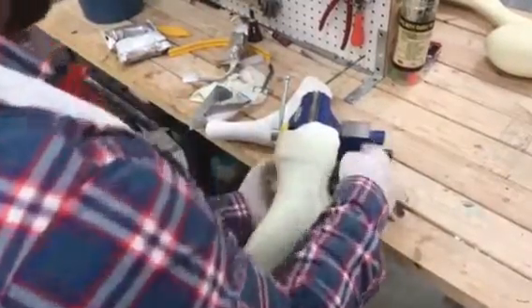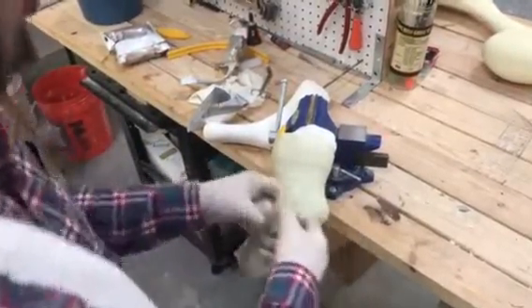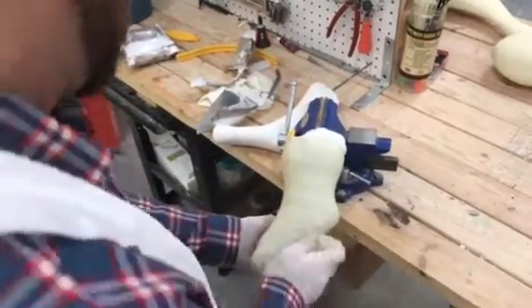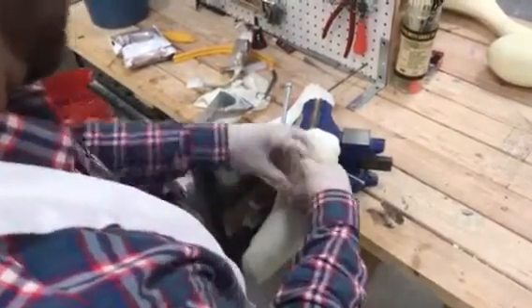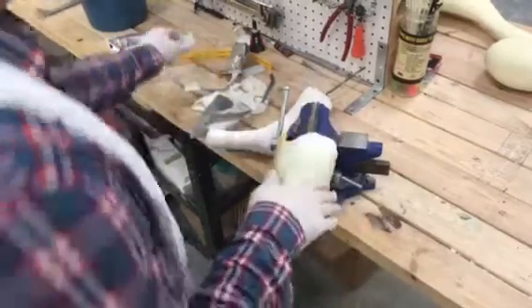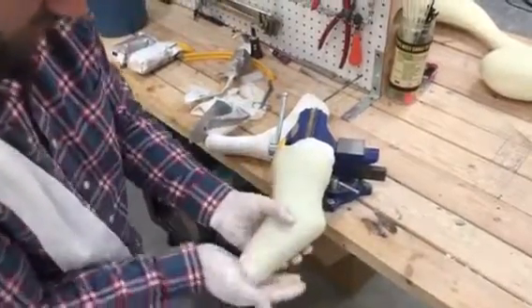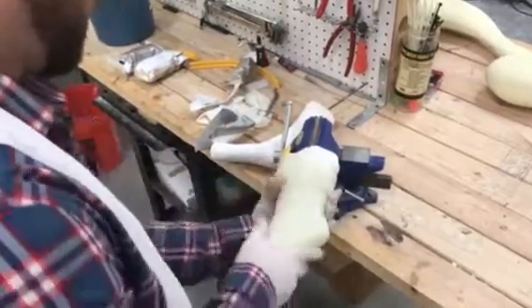From there it's just reinforcing the cast. This is a soft, flexible casting material, so it's very easy to remove from the pet or patient. You want to go about three layers thick with this flexible casting tape. If you ever have hard casting material sent to you, you can do about two layers thickness. From there I'm just going to massage and make sure we get a good mold of the leg all the way around.